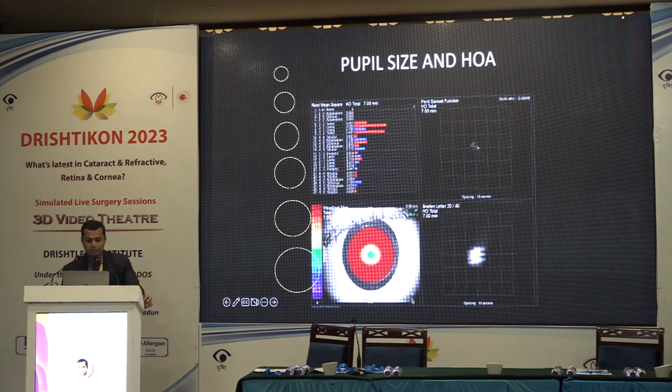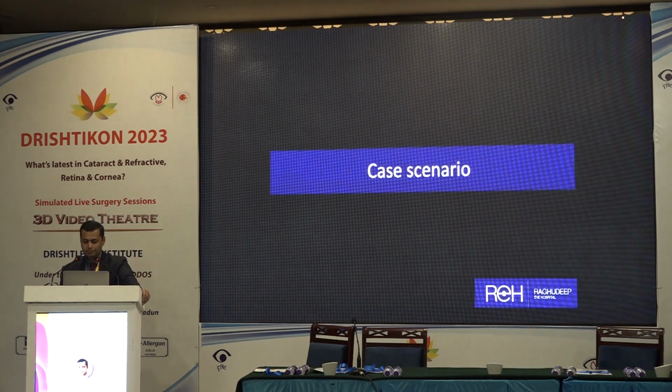And so this is the patient's problem because most often our patients will come complaining of nighttime visual problems or dim light problems. And we check them in our brightly lit clinics, and that's where the problem happens. So it's very important. Please turn off the lights in your diagnostic room and investigate them there, and you'll end up knowing much more about them.